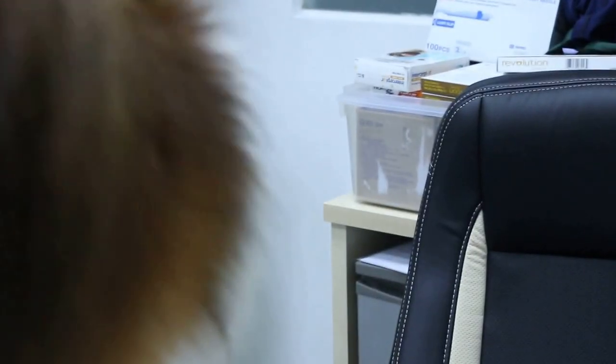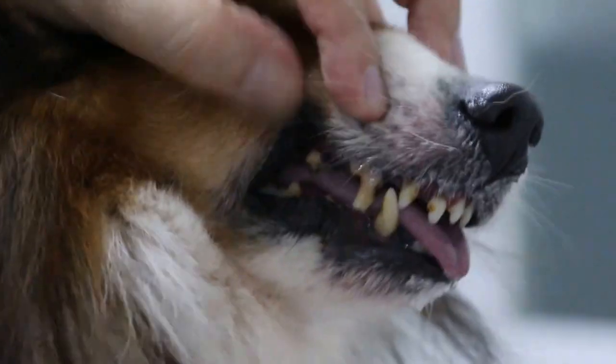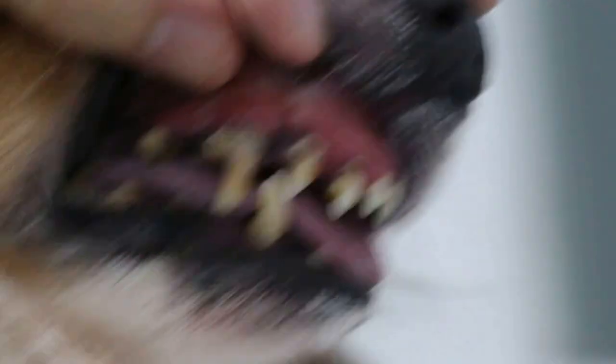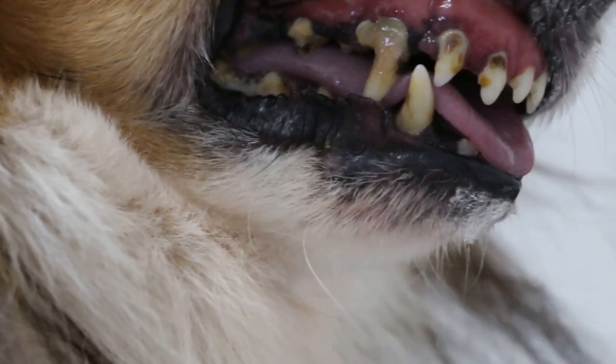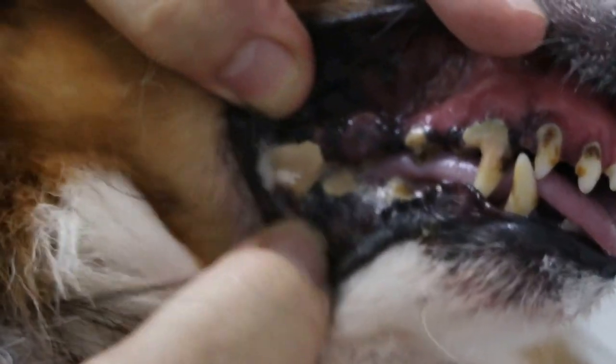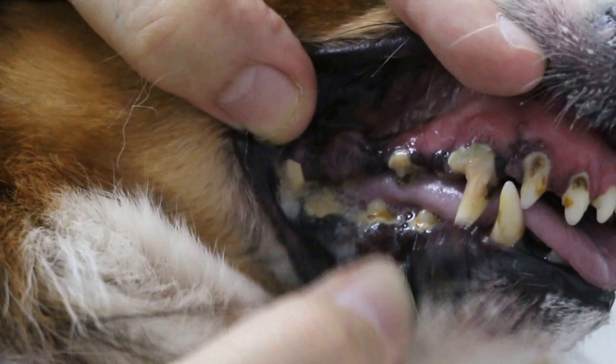What is Premolar 4 on the left side? On the right side, I will examine the dog. Now, he's a bit nervous. On the right side, you can see the canine tooth, all exposed gums. So, with the tissue attachment loss, this is grade 4 periodontitis. This tartar is also thick here. For 7 years, there was no dental scaling.